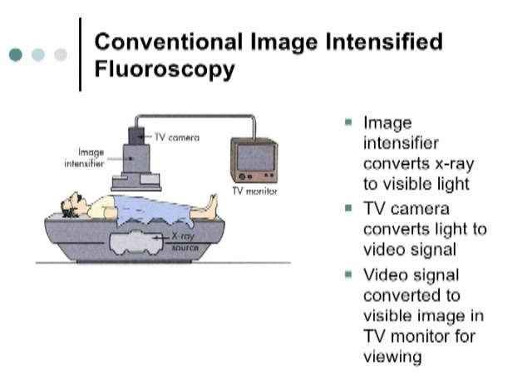Just knowing that the television camera tube, which is a glass vacuum tube with a cathode and an anode, is subject to burnout. When your fluoroscope goes out, it's usually the camera tube that burns out because it's got a smaller filament in it.